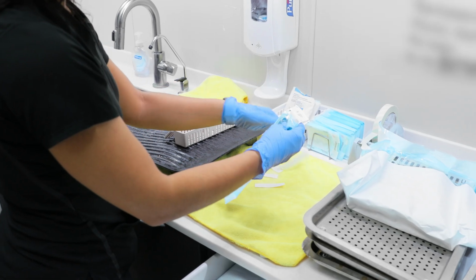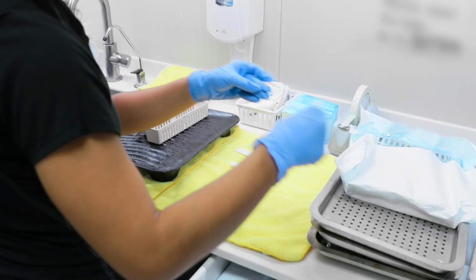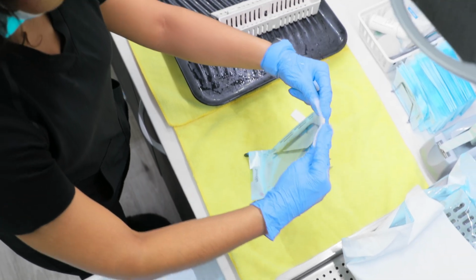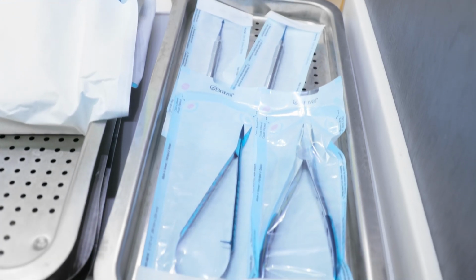All stainless steel instruments should be placed in separate sterilization pouches and not with any carbide instruments during instrument processing. All hinged instruments must be autoclaved in an open position.